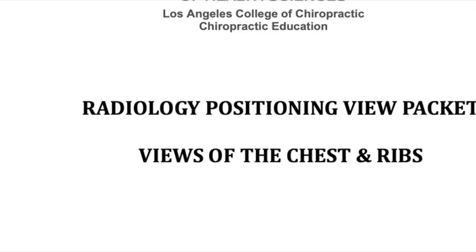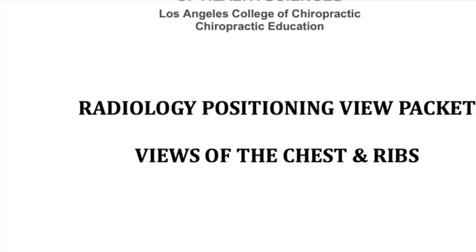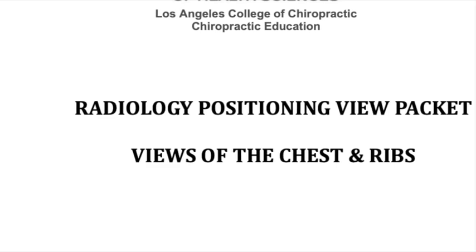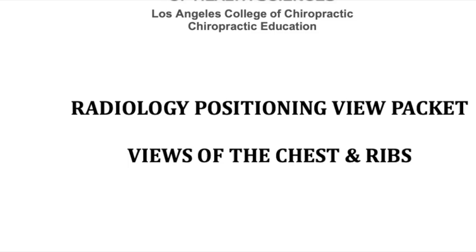The evaluation criteria for a successful lateral chest view include the complete visualization of both lung fields, including the costophrenic angles, with the entire thorax visible. Any artifact overlying the chest renders the study non-diagnostic.